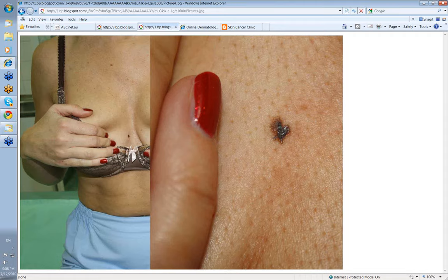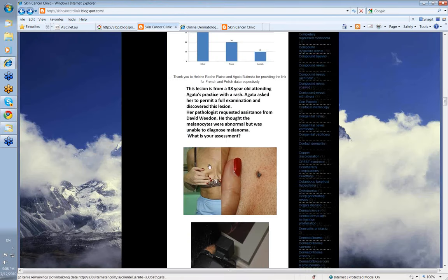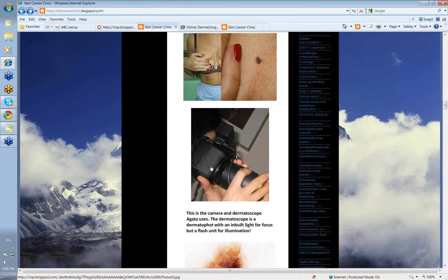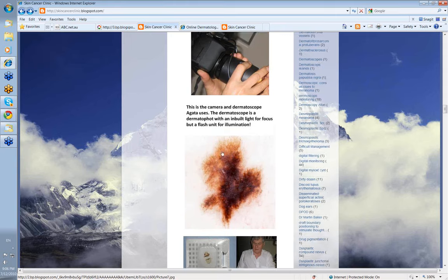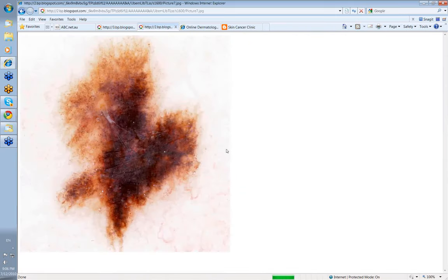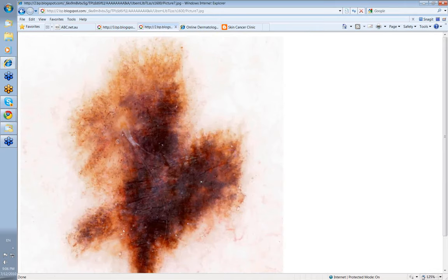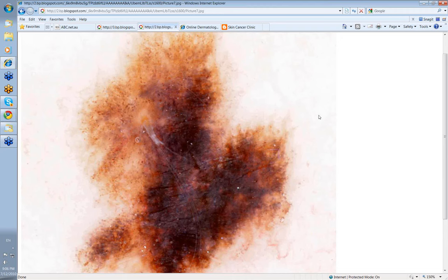So of course I get to put a dermatoscope on it. Let's have a little look at the dermatoscopic view. We'll make that just a little bit bigger. Cliff, what are the main features that you see in this?